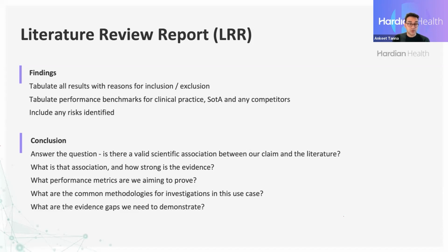What performance metrics are you aiming to prove, and what are the standard performance metrics? And what are the common methodologies used for investigations in this case? And again, in the conclusion, it's important to mention any gaps in the literature which you may intend to fill using a feasibility or proof of concept study.